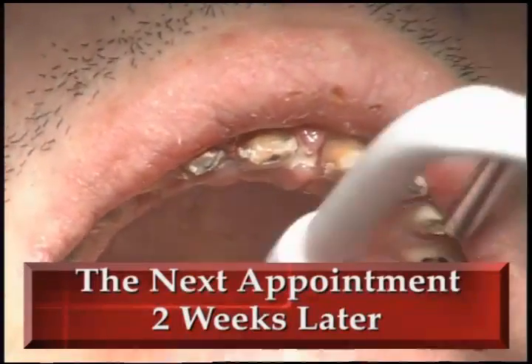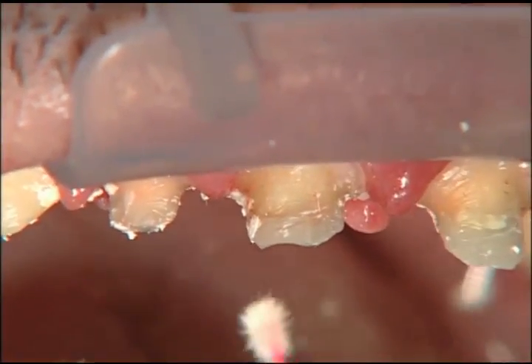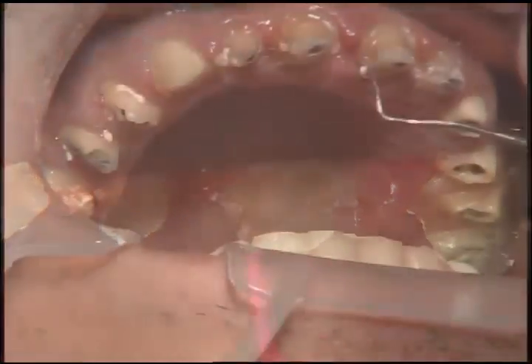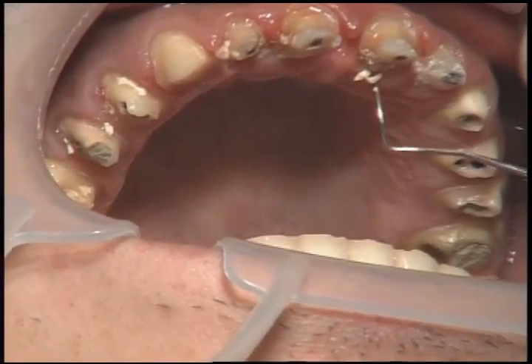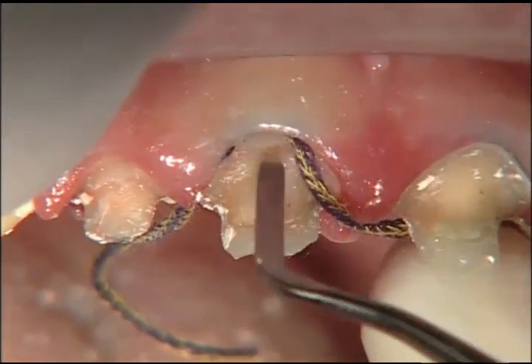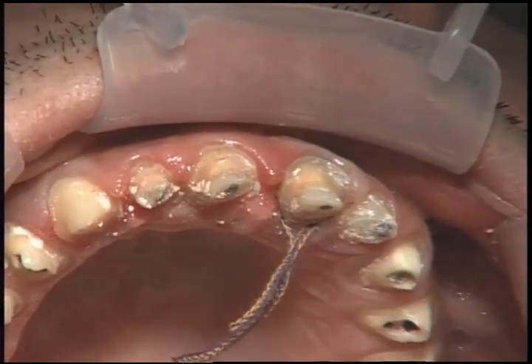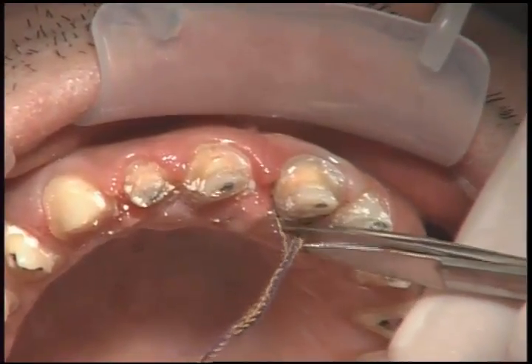About 10 days later, we have the patient back. At this appointment we're going to take a look and see how everything looks, and we're planning on taking the master impression if we can. The main point is it's really difficult to get great restorative results, especially in the anterior, if you take your master impression on the same day that you prepare. The best way to do it is to prepare the teeth on the first appointment, get the temporaries on, get the patient back again, take the temporaries off, and make sure your margins are all still where you want them to be. You're able to drop any margins down if they need to go a little farther, about half a millimeter subgingival. Then when you put the temporaries back on, there won't be any change because the tissue is in a stable position from the temporaries having been on for the two weeks prior.